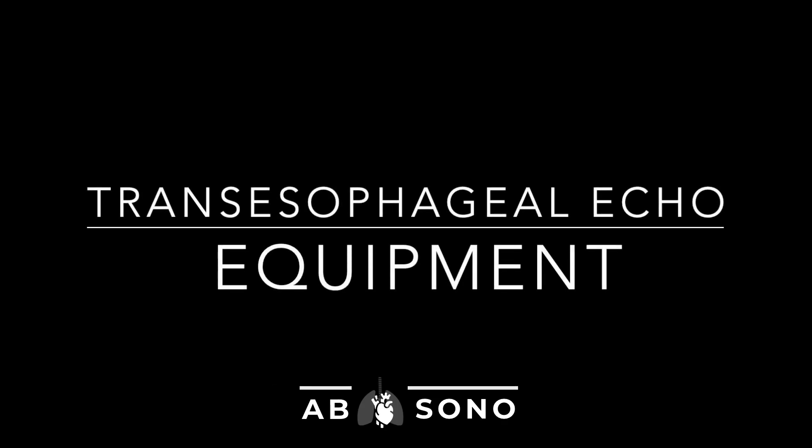In this brief video, we will explain to you the equipment needed to perform transesophageal echo, the cardinal movements of operation, as well as how to clean and care for the probe.